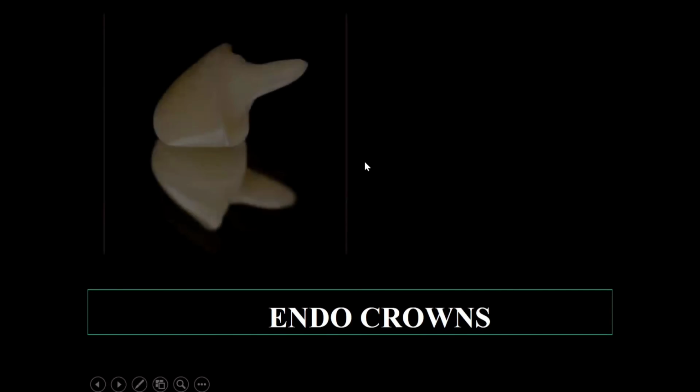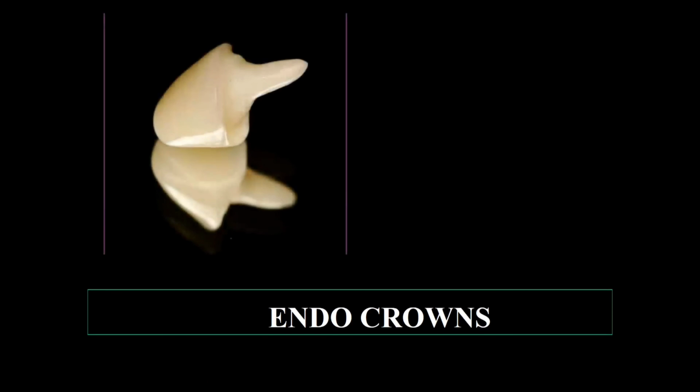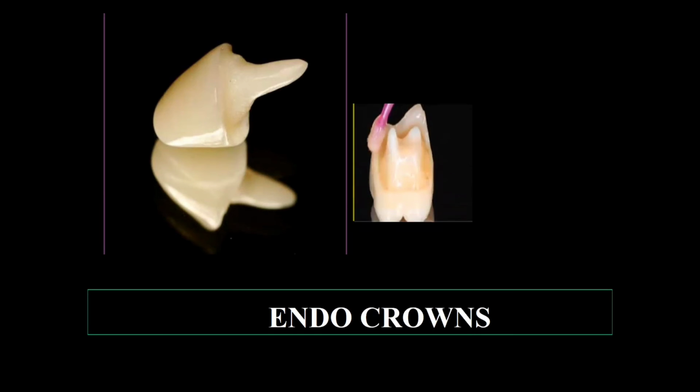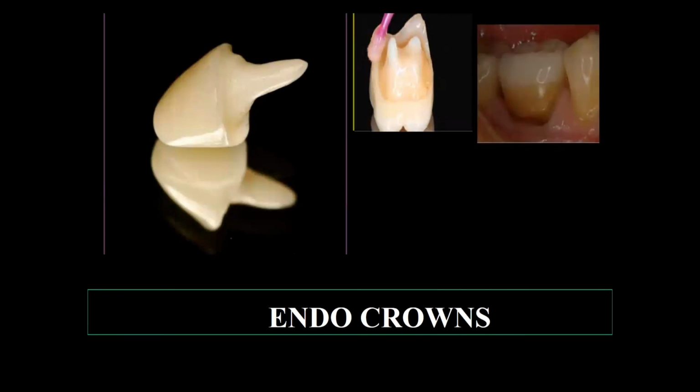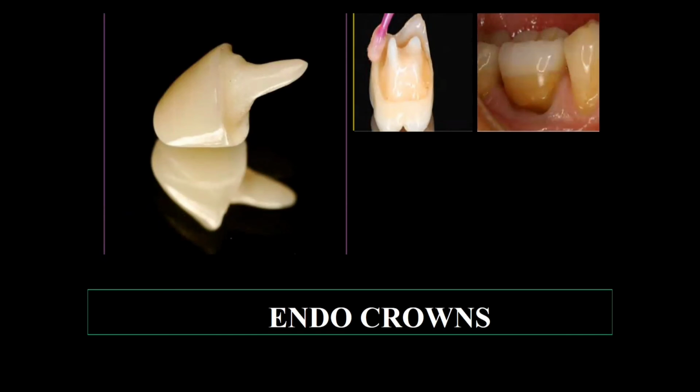Endo-crowns. Traditionally, the functional and aesthetic recovery of endodontically treated teeth with extensive coronal loss has been achieved by fabricating total crowns supported on cast metal cores. But with the development of intraradicular posts made of glass fiber and of the technique of bonding to dentine, resulting from the development of resin materials, the restoration of endodontically treated teeth became simpler, more economical, and biocompatible.